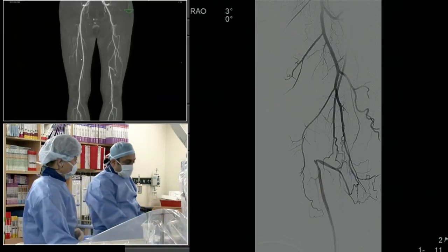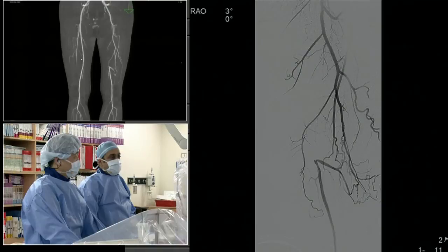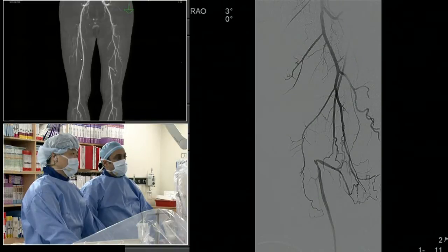And one last question about atherectomy. What about embolic protection? If we were to embark on atherectomy here, would you always use embolic protection, use it selectively, or never? I was a huge believer in distal protection prior to DEFINITIVE. DEFINITIVE had a 20% embolic protection rate with only a 3% embolic event rate. So of the 80% that did not get distal protection, it seemed irrelevant. I think the patients who really require distal protection are those that are thrombotic rather than atherotic, those with heavy calcification, and those with single vessel runoff. This runoff looks relatively good. I don't think you need distal protection if you were going to choose atherectomy with a directional device. Fair enough.